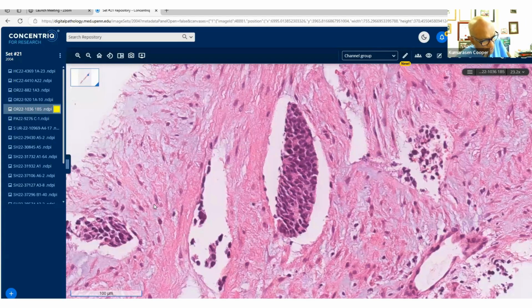There's no other immunohistochemistry that can help you. You can have variable ER like you asked for. That's fine. And you can get some smooth muscle, which is fine. These cellular areas are not a feature of that tumor. These highly cellular areas that we are looking at. So the background, probably deep angiomyxoma might fit.